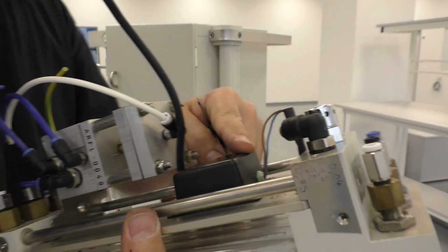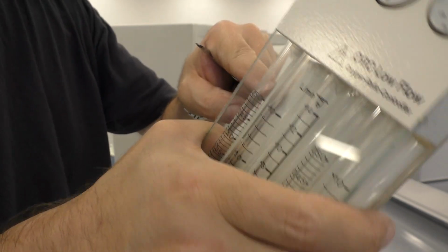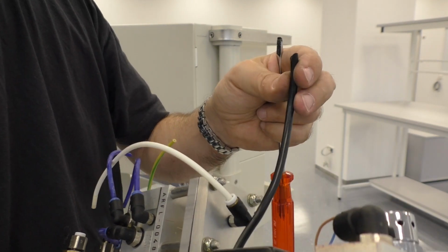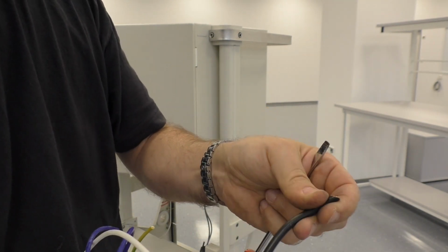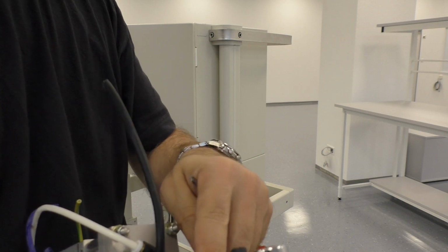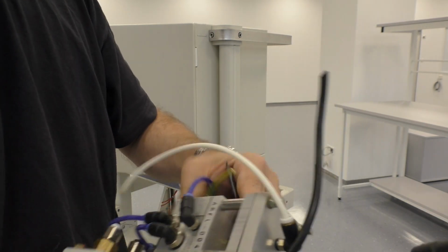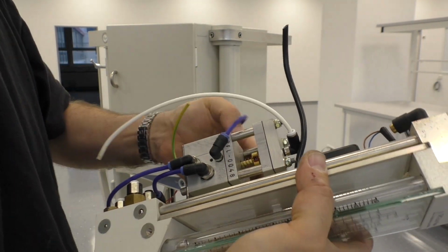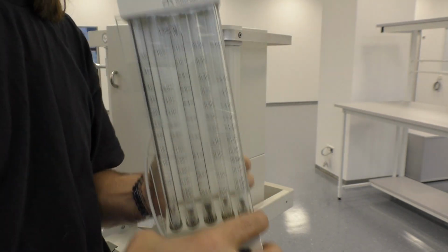Then we have an inverter with 2 cables that go to this background illumination. It's some sort of electroluminescent illumination. Let's see if we can power that up. I'm not sure what input voltage we need. It looks a little bit like a mains cable, maybe 230 volts. I'm not sure. Maybe I better start with a lower voltage, or unscrew the cover and maybe we find that out. There is some sort of switching valve regulator. Yeah, it's a pure mechanical thing that looks nice.